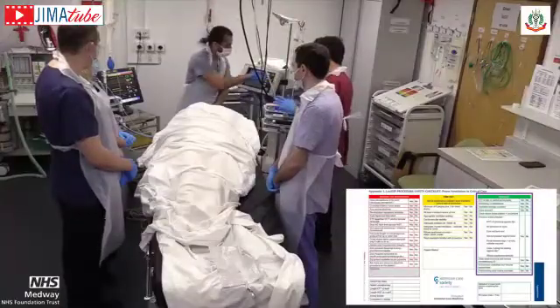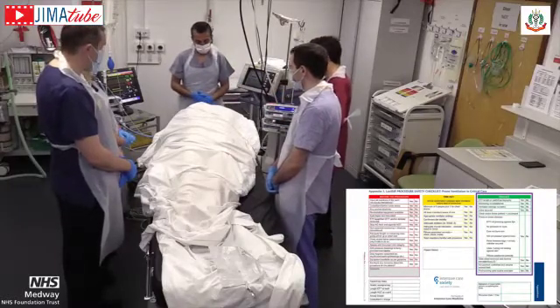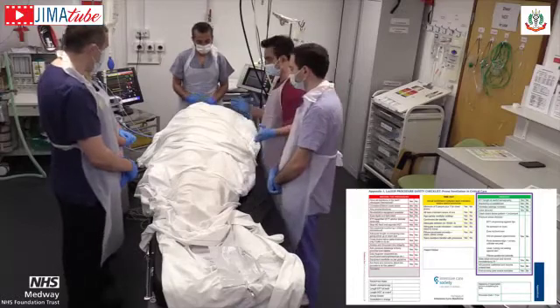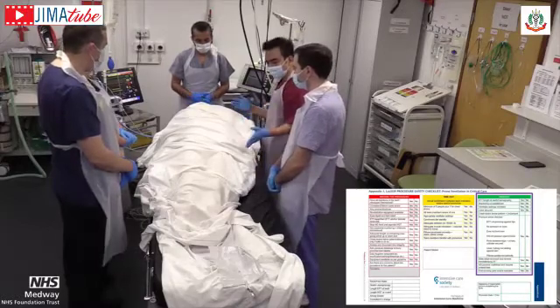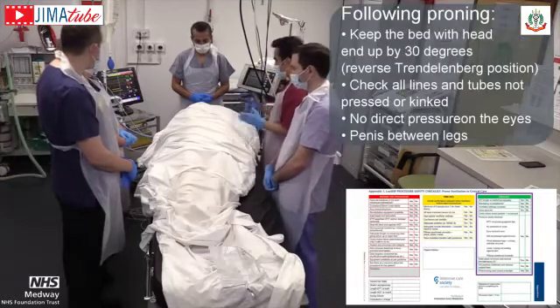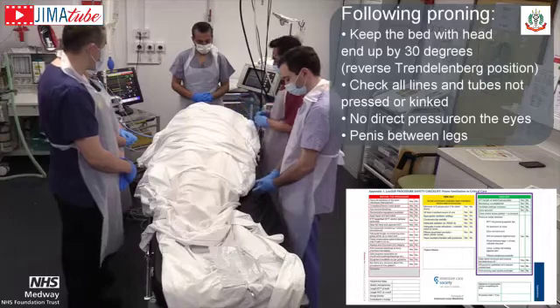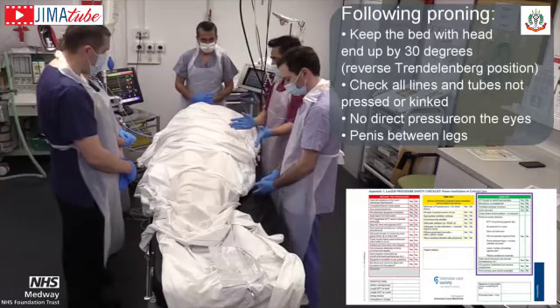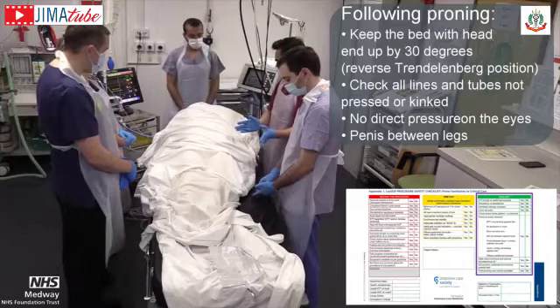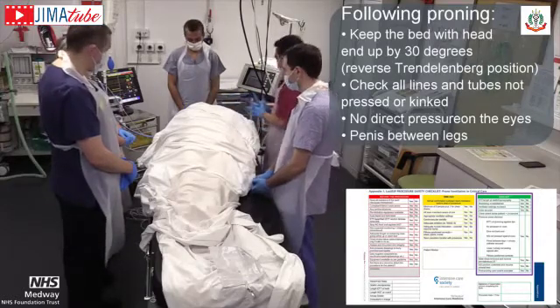Now that's quite nice. He's only got his forehead supported by the pillow. Sometimes, depending on the size of the patient, we have to move the mattress downward first and then get the patient upwards, depending on the size and the space you have got. Here we are okay, but there are often situations where we move both the patient and mattress together downwards and then get the patient up to make the space. Here we are quite happy with it.